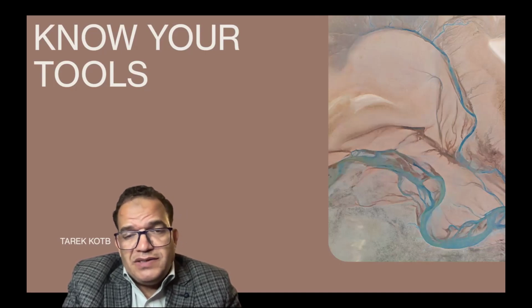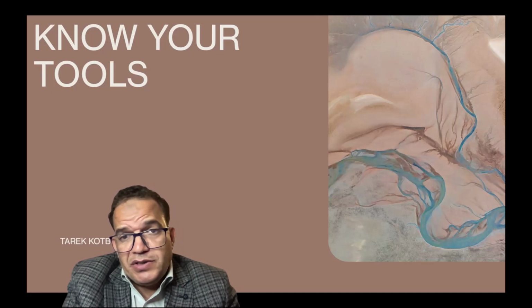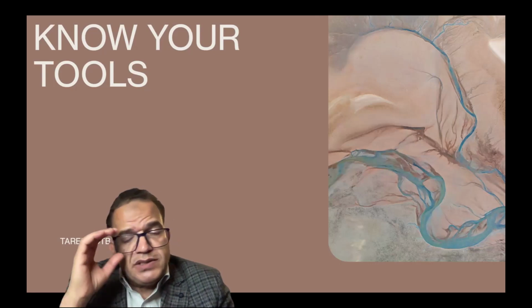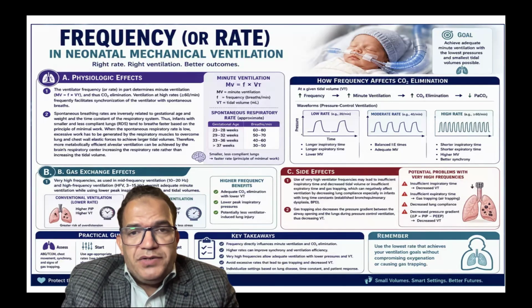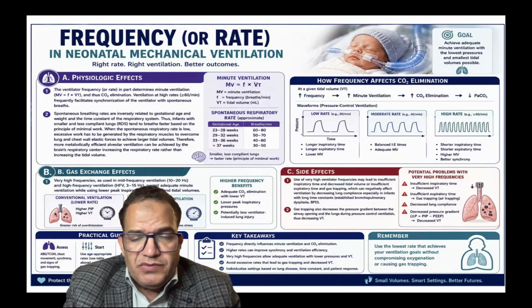The first one is the ventilator rate. Then you set the inspiratory time, you set the pressure, which is the peak inspiratory pressure, you set the PEEP, which is the positive end expiratory pressure, and you set the FiO2. If the baby is on targeted tidal volume or volume guarantee, you set the volume between 3 to 5 ml per kilo. Don't be overwhelmed by the big slide, because we will talk about just a few things and most of them are repeated.